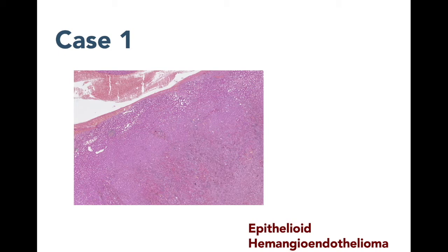Of course, the vascular markers are really helpful, and CAMTA1 immunohistochemistry needs to be further investigated for the diagnosis, in particular for the differential diagnosis with angiosarcoma, which is much more aggressive. So epithelioid hemangioendothelioma is not really a benign tumor because it can grow really quickly. It can be hard to remove. You may need to perform a liver transplantation, and you may also have distant metastasis. And it's really difficult to predict the clinical outcome.